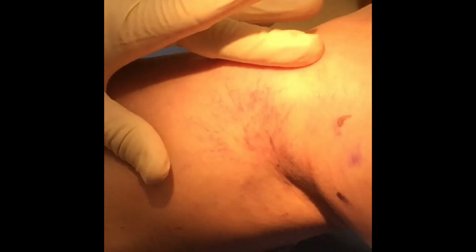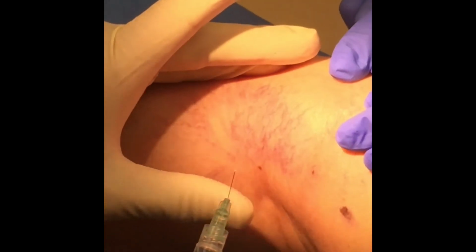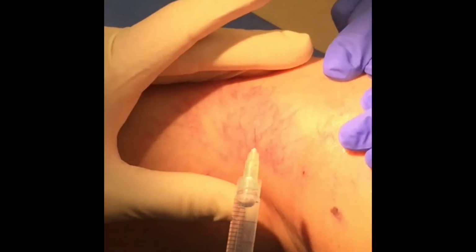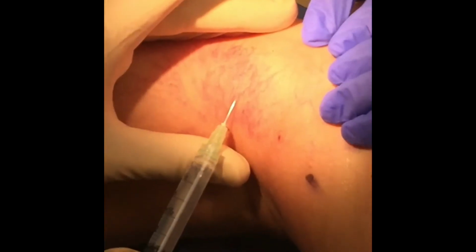Okay, now that we've treated the feeding varicose vein, we're now going to do spider vein sclerotherapy on the inner part of her knee. And it's really, really nice that Marissa is pulling back on the skin. That helps to pull away the nerve branches so that she feels it less and pulls the skin very taut. It makes it a lot easier to do this procedure.